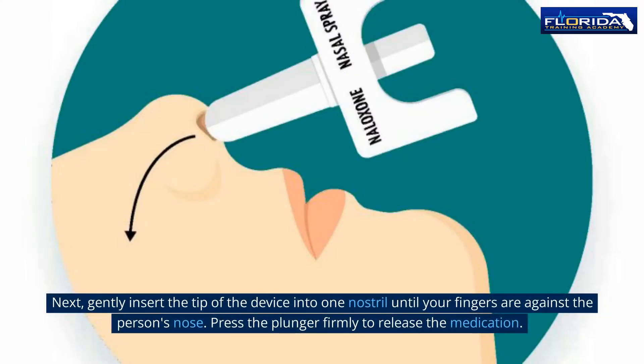Next, gently insert the tip of the device into one nostril until your fingers are against the person's nose. Press the plunger firmly to release the medication.